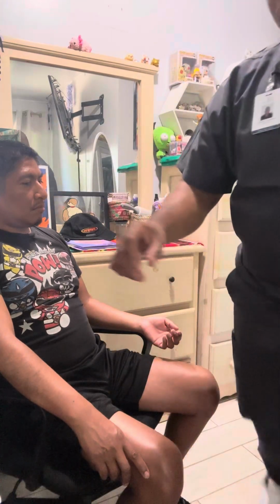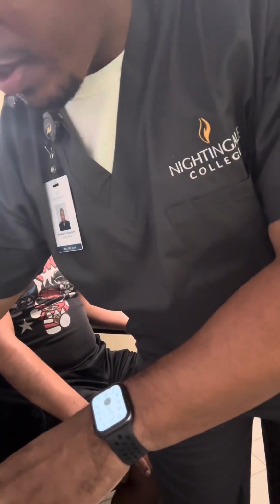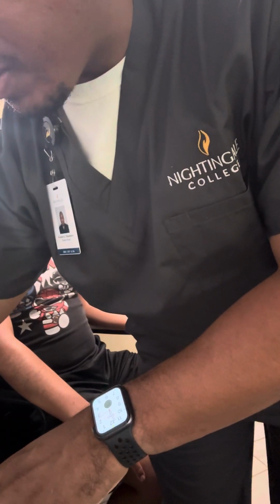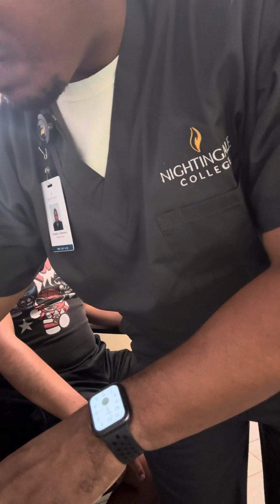So go ahead, write down what I've put, 66. That would be his pulse.